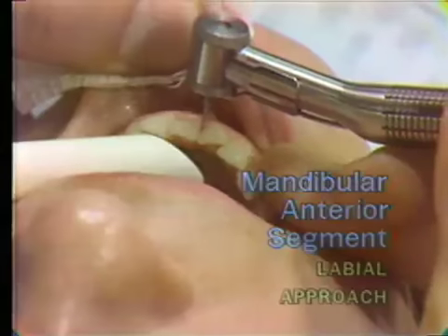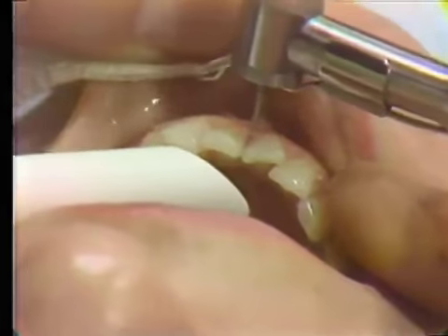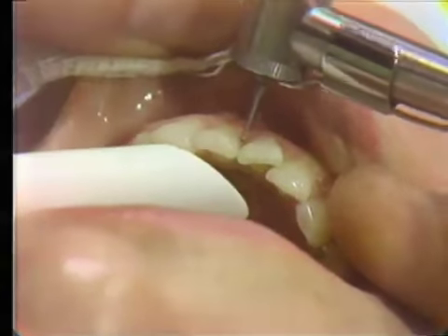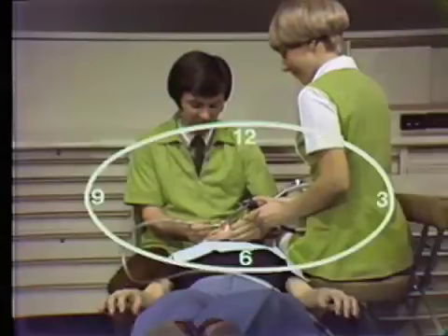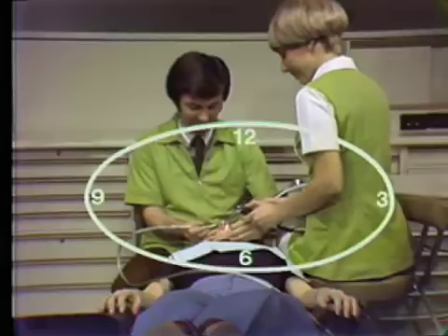Most operators appreciate the advantage of using direct vision whenever possible. Such is the case when treatment is carried out in the mandibular anterior segment using either the labial or incisal approaches. With the patient supine, the operator can work comfortably from either the 11 or 12 o'clock positions. The patient's head is turned toward the operator as needed to improve access. A slight chin elevation is usually helpful in improving visibility.